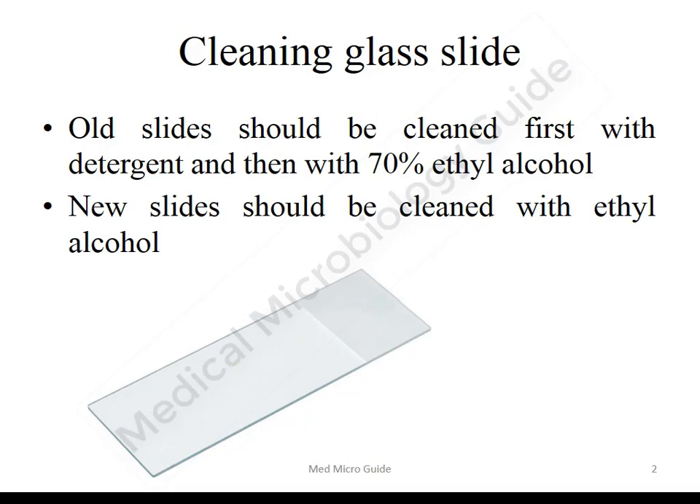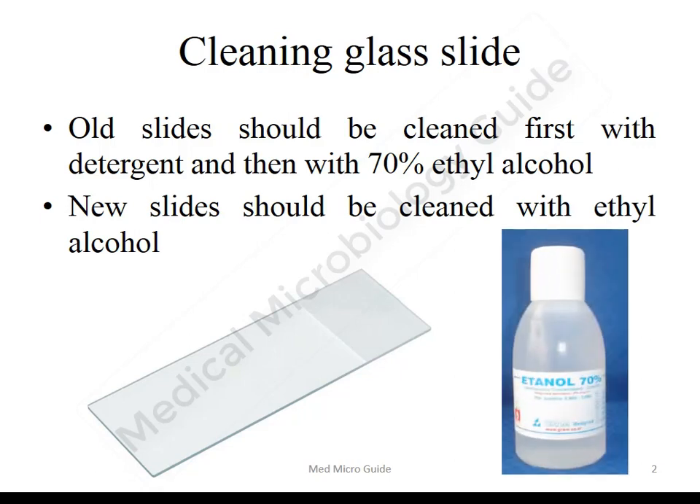The glass slides supplied by manufacturers will have dirt and grease on their surface. They are cleaned first with a detergent and then with 70% ethyl alcohol. If you are using already clean slides which were kept for a longer time, then we have to clean them again with 70% ethyl alcohol before use.